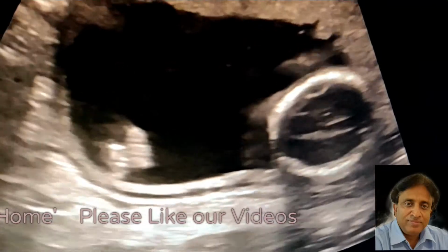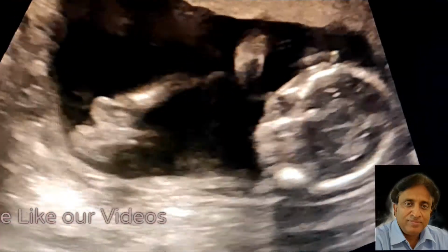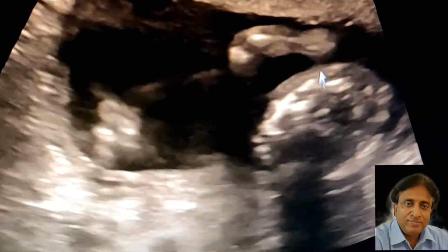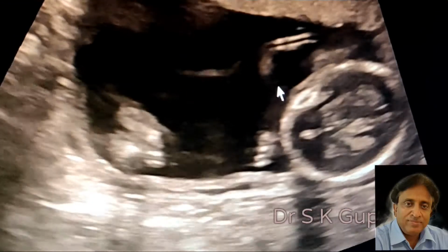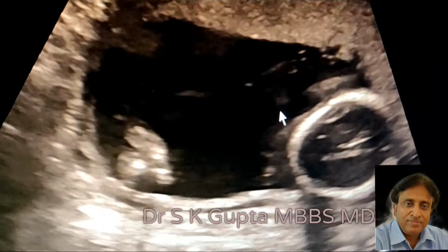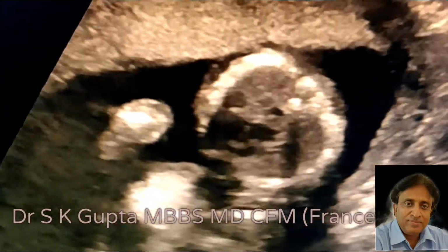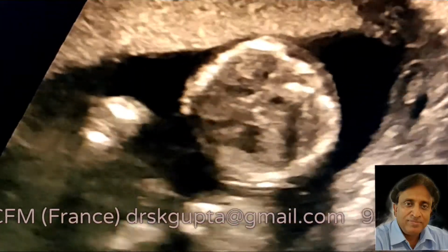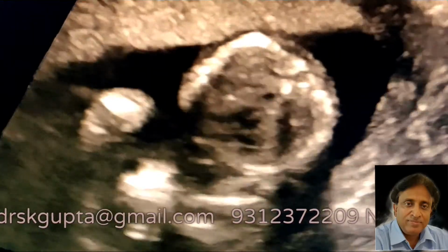You can see that there is active movement of the lower limbs over here. These are the lower limbs which are actively moving, and this is the upper limb over here, and all 4 limbs are mobile. Whenever you come across any congenital anomaly, it is important to look for associated congenital anomalies. The heart over here appears to be normal.